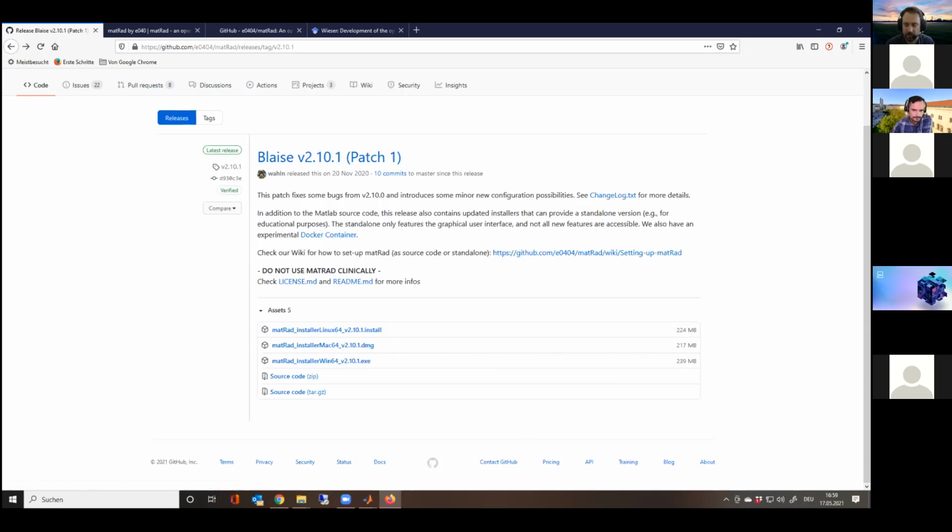As Hans-Peter said, there might be some pitfalls, but he will show this. I hope you're already downloading, because this is my talk to skip the time while you are downloading, and also to give some information. The next thing is the Windows executable. That's the most tested one. It's not tested on Windows XP or something like this, and probably it's not supported.